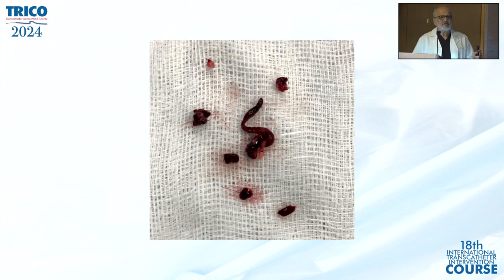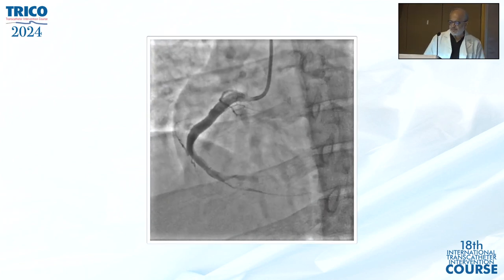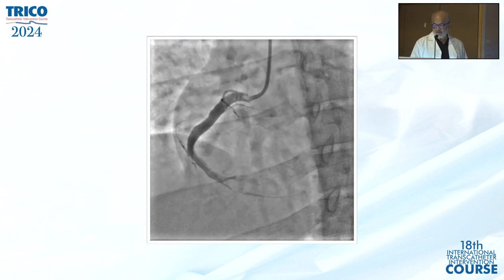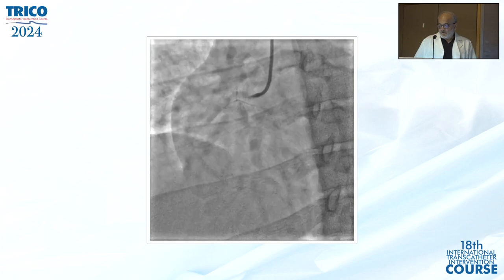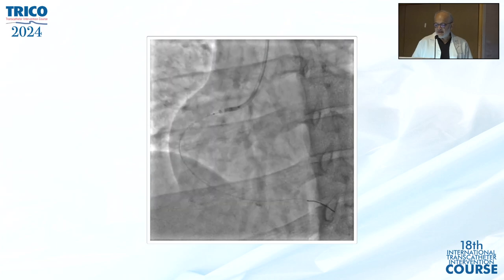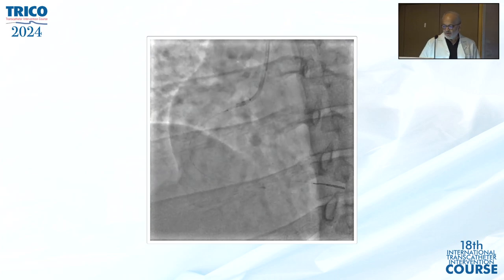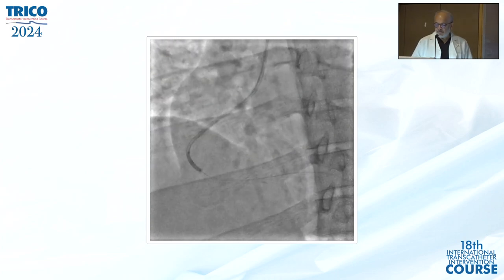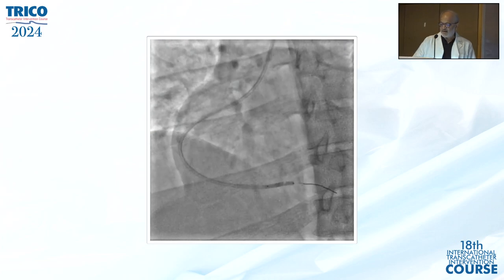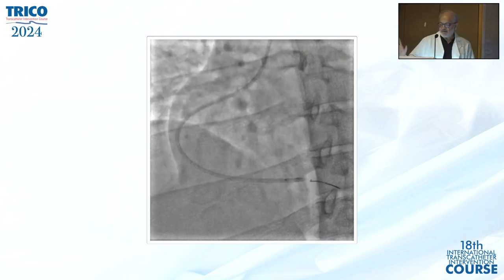Made sure that patient is moving all the four limbs properly. Again went in. This was what was seen. Here, now PDA and PLV both were completely filled with thrombus. So I thought that PLV is bigger, and again balloon assisted tracking, 3 or 4 atmospheric pressure, 2.5 balloon, went up to here, and then again right inside the PLV. You can see, removed everything again.